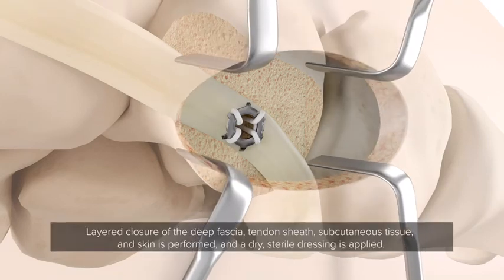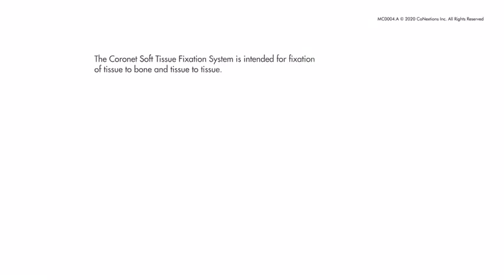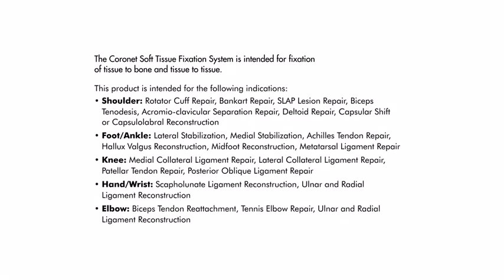Layered closure of the deep fascia, tendon sheath, subcutaneous tissue and skin is performed and a dry, sterile dressing is applied. The Coronet Soft Tissue Fixation System is intended for fixation of tissue to bone and tissue to tissue in a variety of indications.